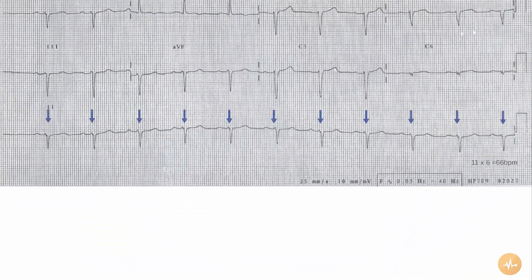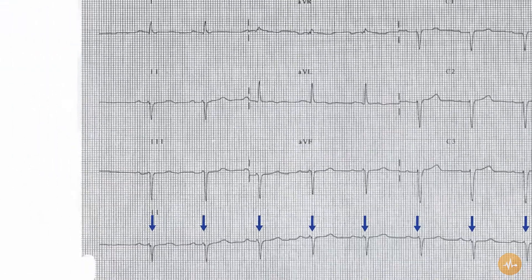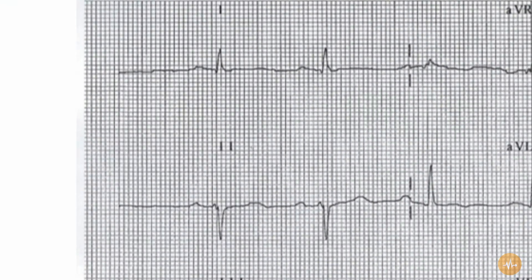The rate is 66 beats per minute. The rhythm is normal sinus rhythm. There is left axis deviation with an up-going complex in lead 1 and a down-going complex in lead 2.